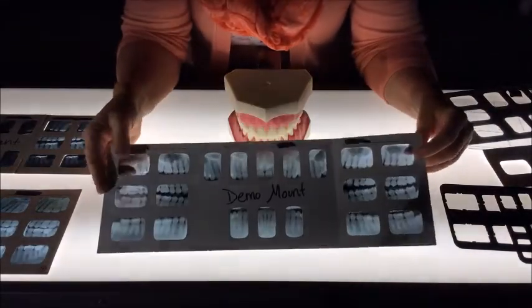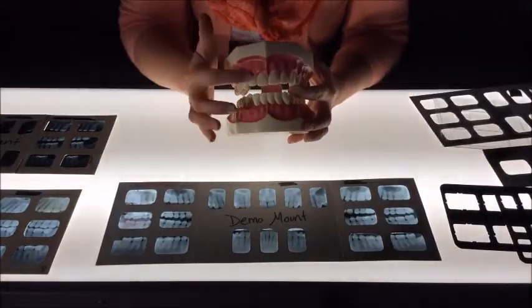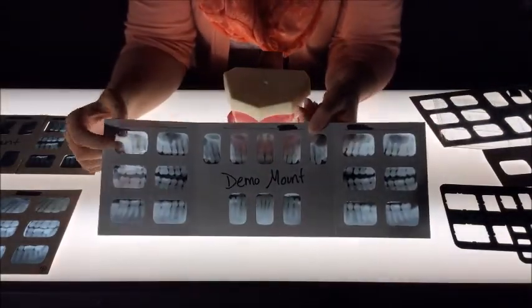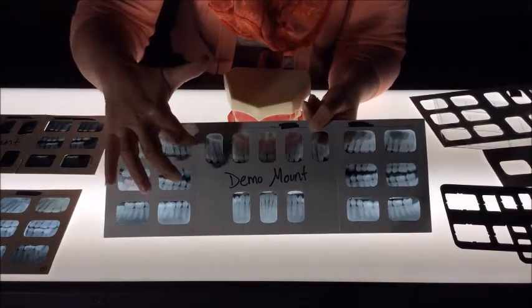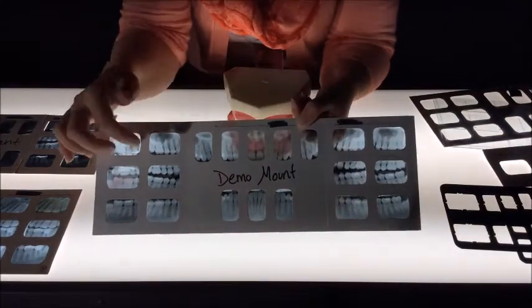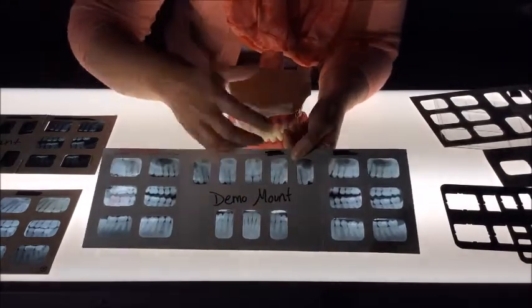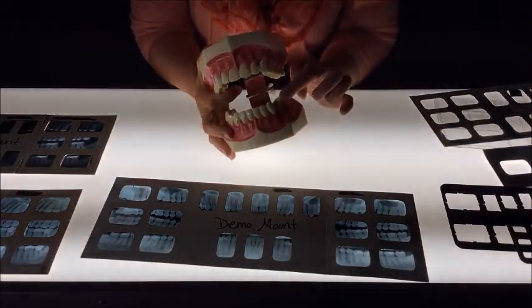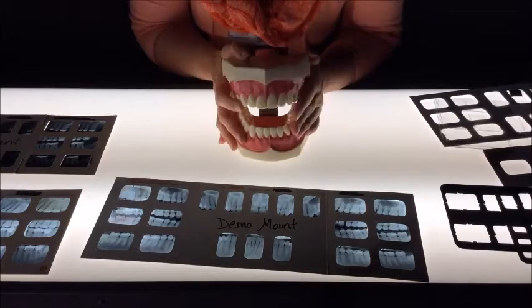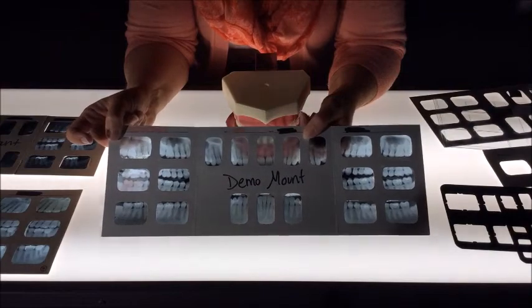You have the anterior teeth in the front, the posterior teeth on the sides of the mount. Also, if you notice, just like the jaws that are in front of us, the upper jaw is known as the maxilla, and the lower jaw is known as the mandible. This is the same way that we orientate our film mount. The upper films are the maxilla, and the lower films are the mandible. The films in between the maxilla and the mandible are showing just the biting surface or the crowns of the teeth that are exposed on the back teeth, known as the posterior areas. These are known as bite wings or interproximal films that help to show decay in between the teeth.